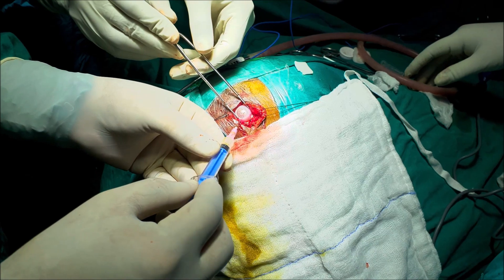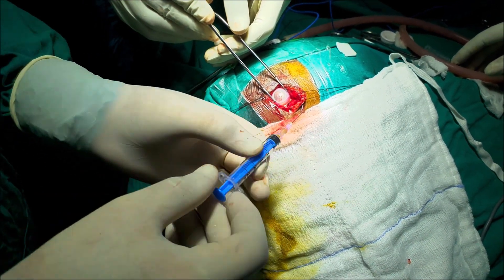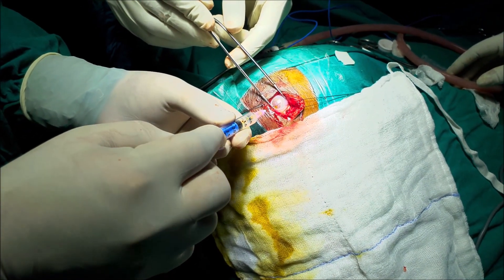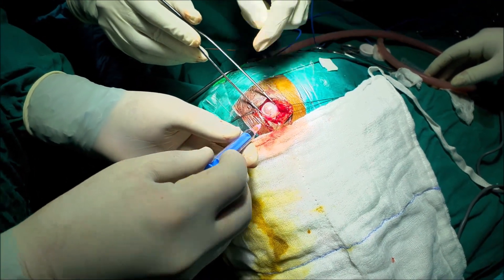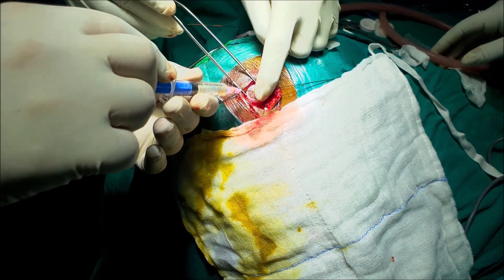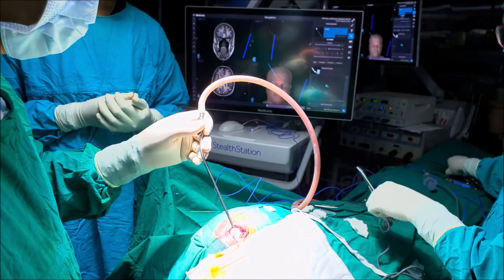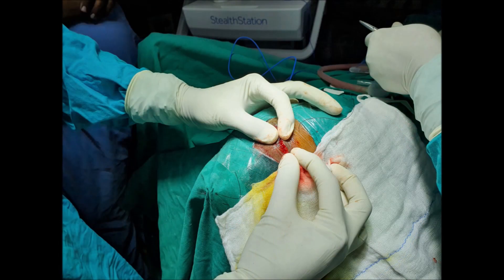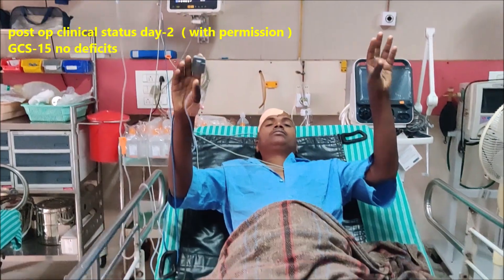Once that is done, we aspirate through the dome of the reservoir to confirm the catheter tip is inside the cyst cavity. The return obtained is very little but yellowish-greenish fluid, suggestive that all cyst fluid has been aspirated and the catheter is inside the cyst. We confirm from all three angles — center and all quadrants — that the catheter tip is in the cyst cavity. The reservoir is then anchored to the galea and the scalp is closed in layers.